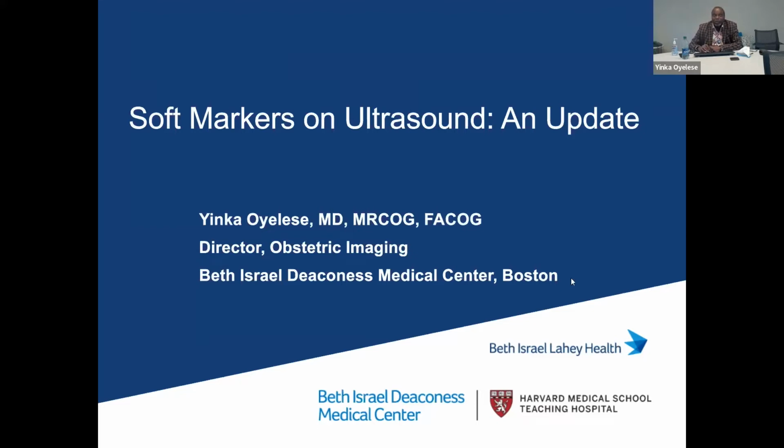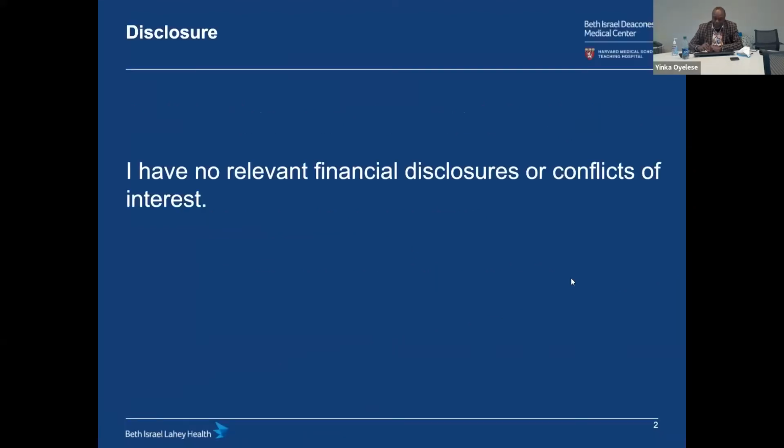Today, we're going to be talking about soft markers on ultrasound and an update. I have no relevant financial or other disclosures.